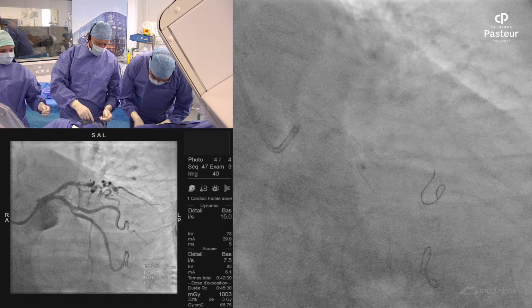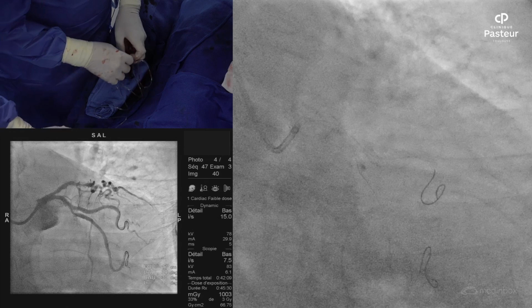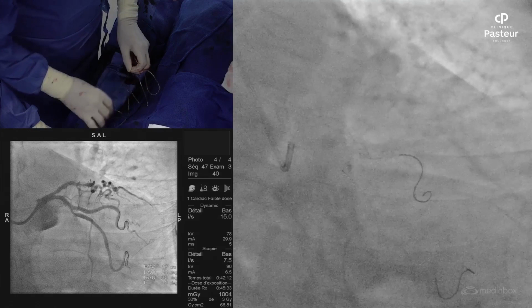So I verify the integrity of the stent. Yeah, the integrity of the stent is good. Sometimes when you do all this maneuver, you can have some difficulty to track it. So always important to check the stent there, isn't it? Because you can lift the edge of the stent in the original attempts to deploy it, and you sometimes see a strut sticking up at 90 degrees.